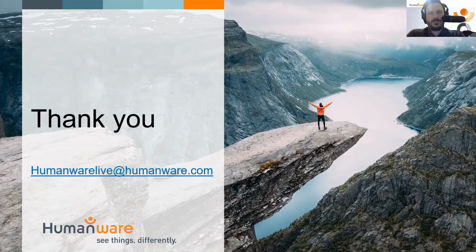Perfect. Okay. Going to the chat, we have two questions here from Karen. Is there Braille support for Microsoft Narrator? The answer to that is currently no. Unfortunately, Narrator does not support the new Braille standard that has been launched, but I am told that we should be able to get that up and running with Narrator in the next release. Once Microsoft push a new update with their Braille TTY, hopefully then our Braille displays will be supported. So I'm hoping maybe in a couple of months here, Karen.